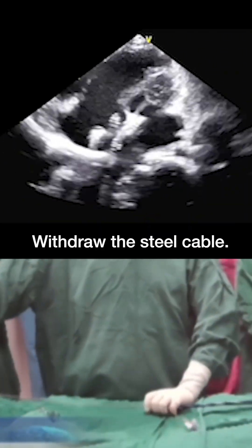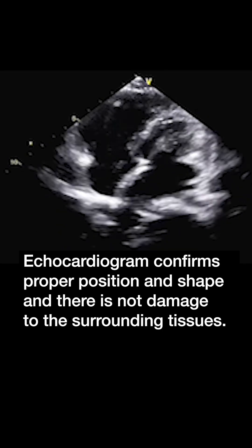Withdraw the steel cable. The echocardiogram confirms proper position and shape, and there is no damage to the surrounding tissues.